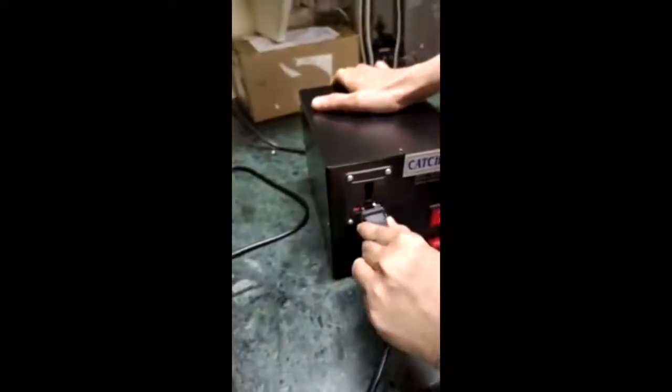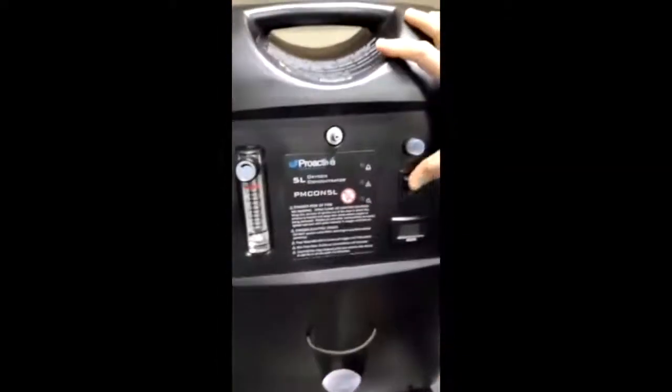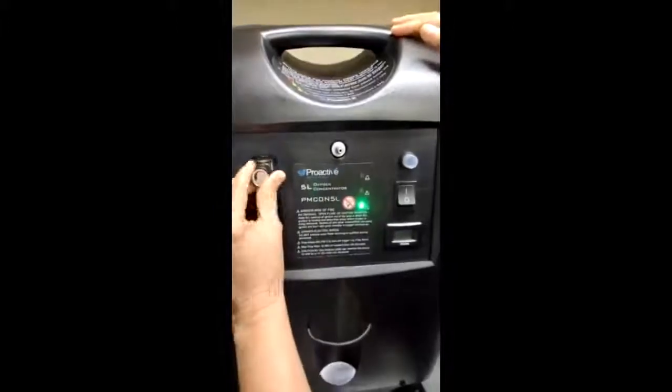Whenever you plan to use this concentrator, ensure that you have a voltage converter. Attach the concentrator to the voltage converter, switch on the converter, then switch on the machine and start your flows.